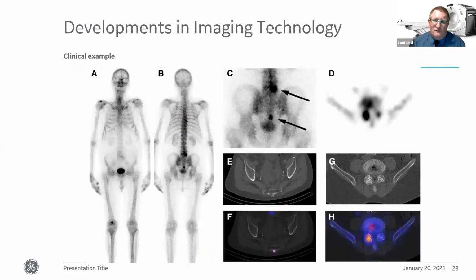The other major benefit we see on scanning is a situation that we've got here as well. We've had a patient who originally came in with lung cancer, and they started suffering from a bit more lumbar spine pain, and they're wondering exactly what's going on. So again, imagine the scenario where we've got attenuation within the patient. You can see on this anterior image that there's something potentially showing down here, but it's very faint because those photons have had to travel through the rest of the abdomen to reach the detector, so they can be masked.